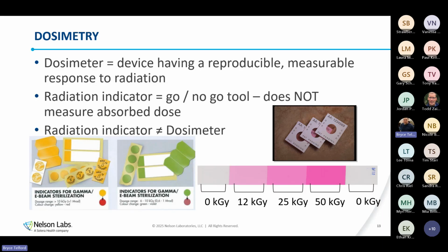This is also a point when I like to tell the story of make sure you do things that make sense. I know that seems like it should be fairly straightforward, but we had a company that had specifically written into their protocol that they could not release product unless the red dot indicator was on the box and red. During their manufacturing process, there was an issue with their labeling machine, and a whole lot of product did not receive its indicator.